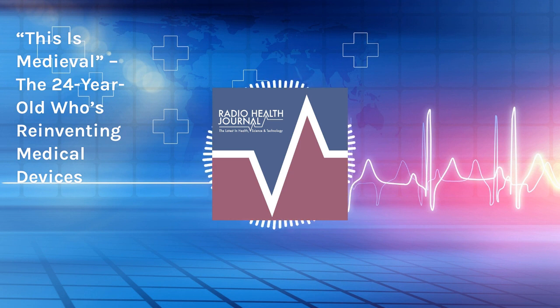And as Potts mentioned earlier, a manual drill takes time. Moving faster increases the risk of plunging, so sometimes it can take a few minutes to break through the bone. Potts was the first person to perform a successful emergency procedure with Qadir's drill last October.